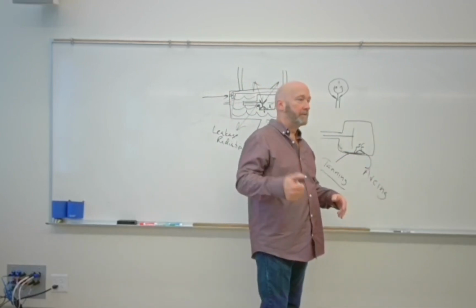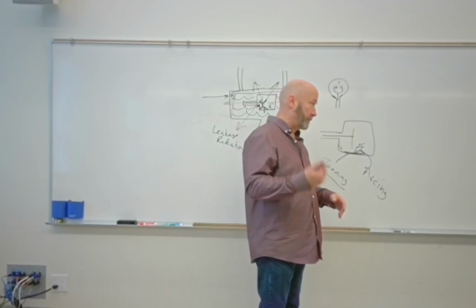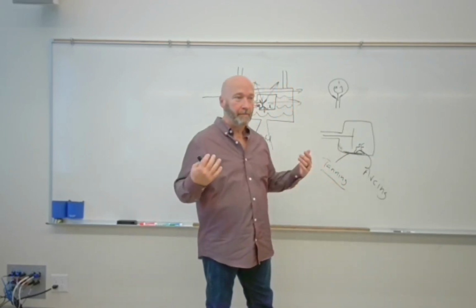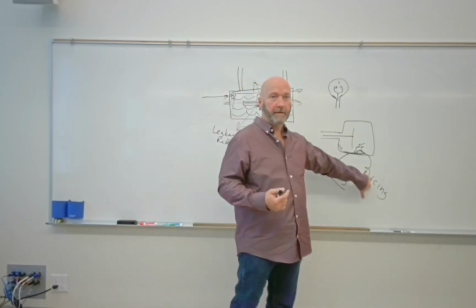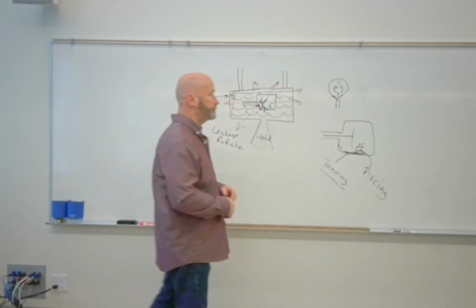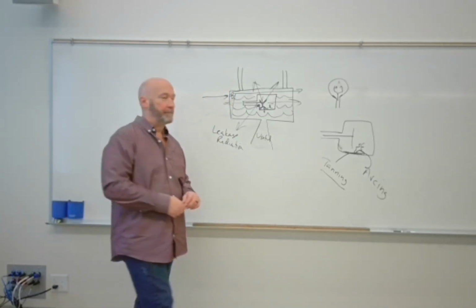Most common cause of instant tube failure. You're clicking along, just making exposure after exposure and after exposure, and then you hear something weird come out of your X-ray tube and you can't make any more exposures. That's what happened, most likely. Okay, arcing. Because of tanning because of heat, right?